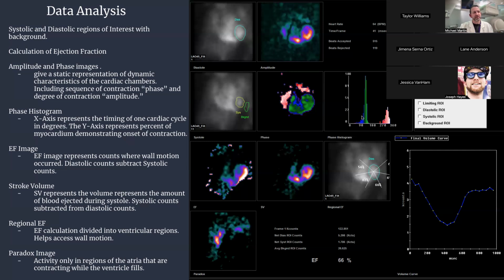So on ours, it's giving you a strength, right? And it's also giving you a time. So you can see first off, here's the ventricular contraction. You can see that's stronger, which we'd expect, right? Again, QRS complex. And then we see here, we see atrial contraction. What's that? That's the P wave, okay, right? And we know that's a smaller wave. So again, what we can see here, though, even in more than that, is you notice that just after 90, if I were to just guess on a number here, it was probably around 100. And you'll notice you go on, and this one's probably somewhere around, excuse me, not 190, probably 290. So we're getting a separation of almost 180-degree difference.